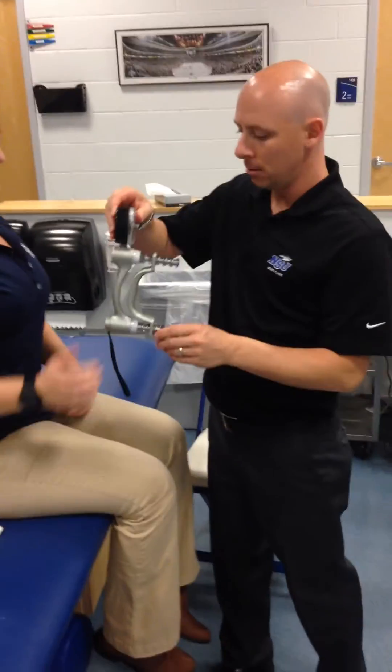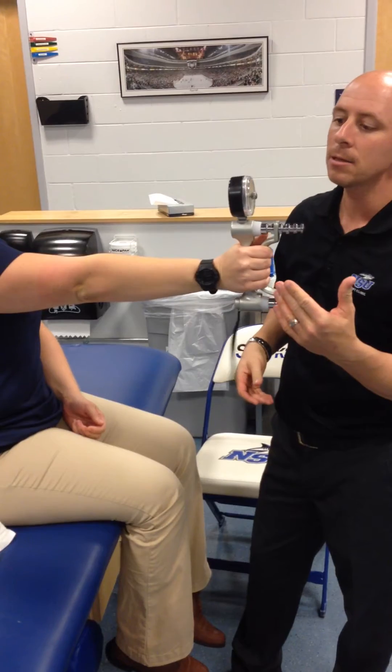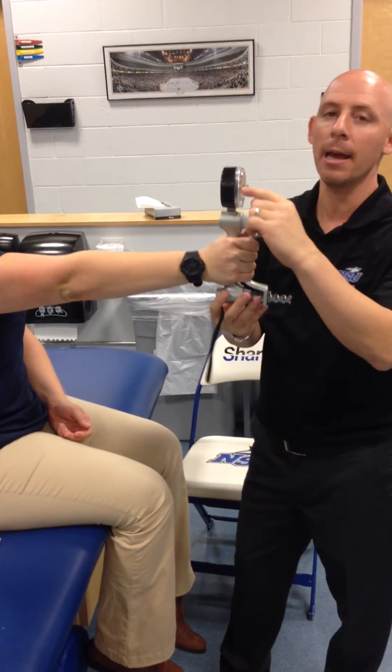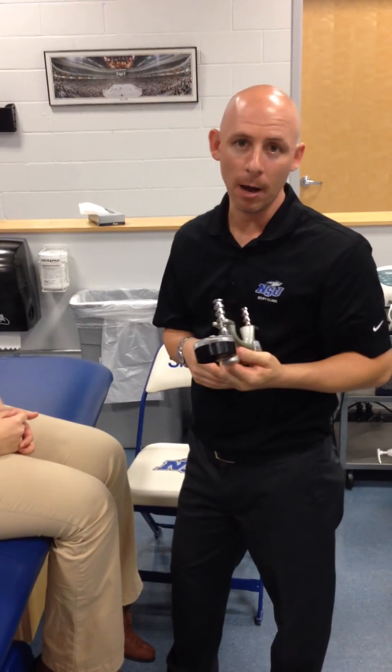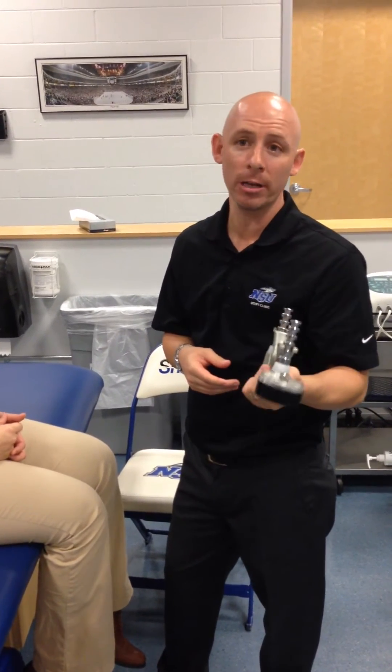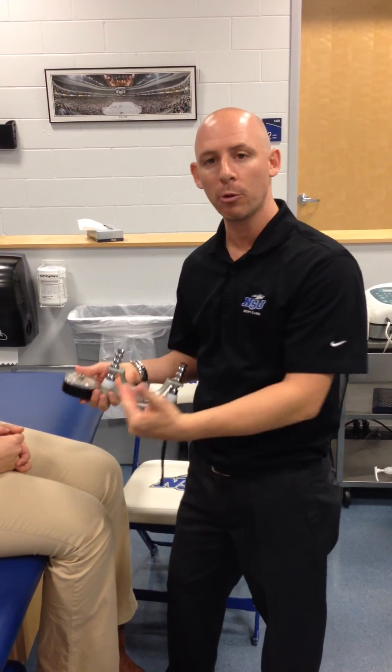Then I'm going to sit her back up, face me. I'm going to give her the dynamometer again, straighten out her arm, and give it a nice big squeeze. What I'm looking for is significantly less pain and hopefully a significant amount of increased force on the dynamometer. I would be happy with any increased force, but sometimes we see great change — up to ten, twenty, thirty, maybe even forty pounds depending on how effective the technique was. If it worked well, I would repeat it three or four times until I got a plateau in her progress.